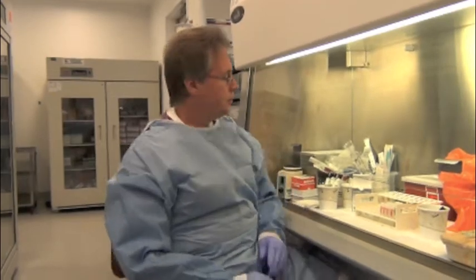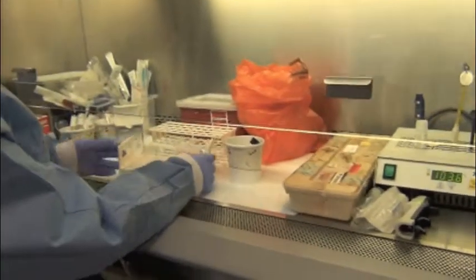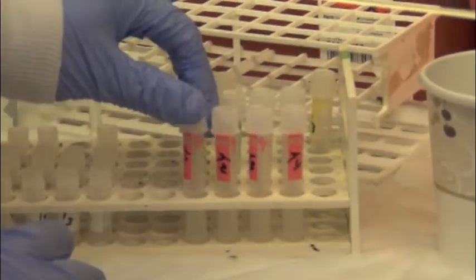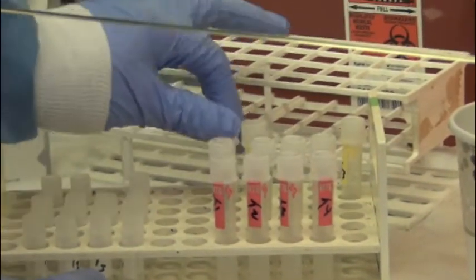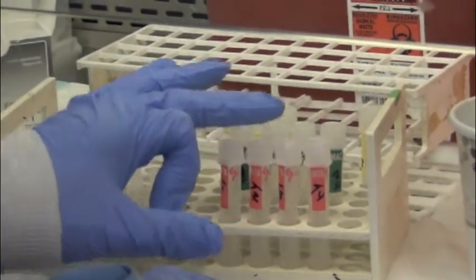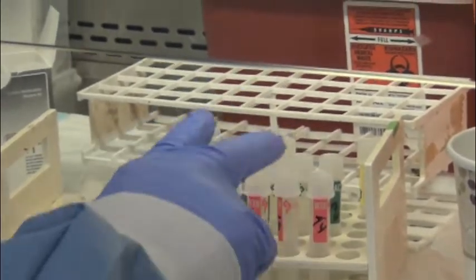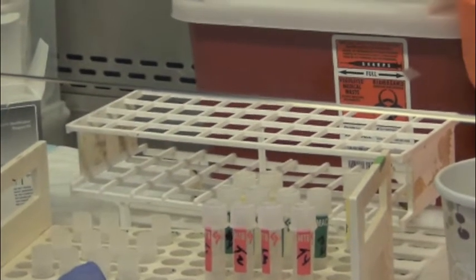Now, what we have here are specific colored probe tubes. The red ones are for MTB, the green ones are for MAI, and the yellow ones are for Mycobacterium gordonae. There is a single-stranded DNA with a chemiluminescent tag in each one of these, specific for that organism.